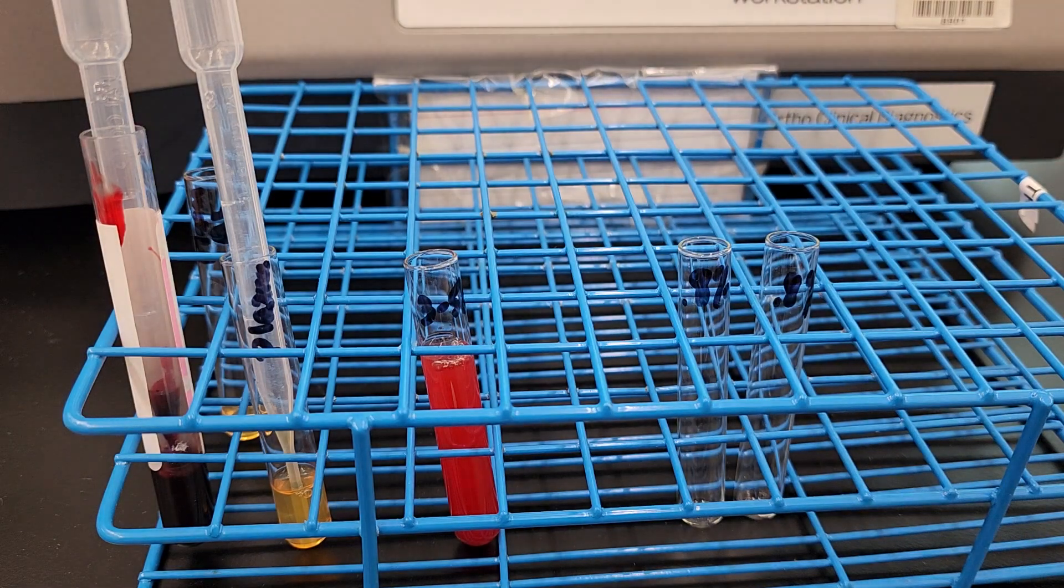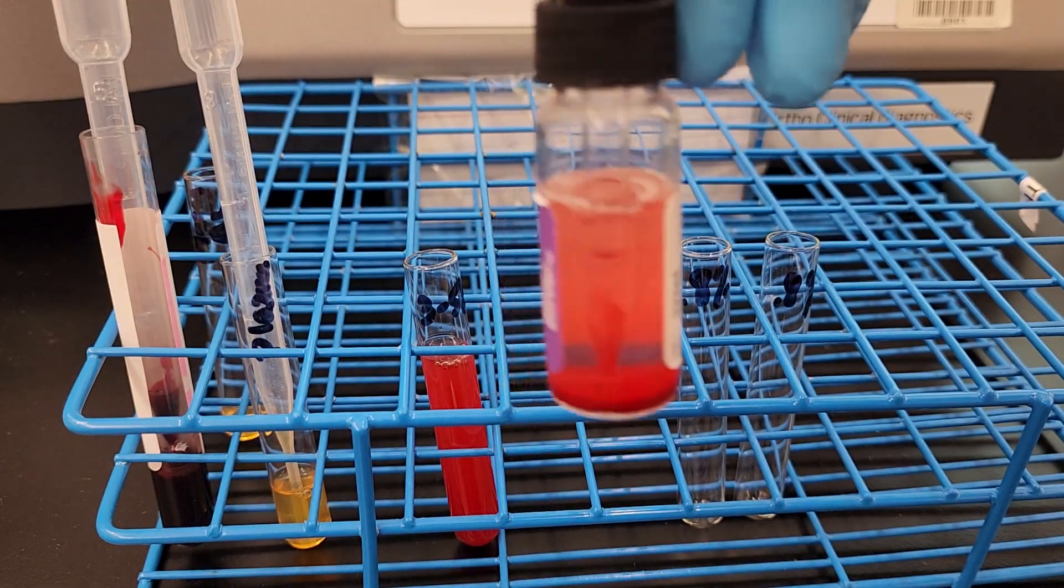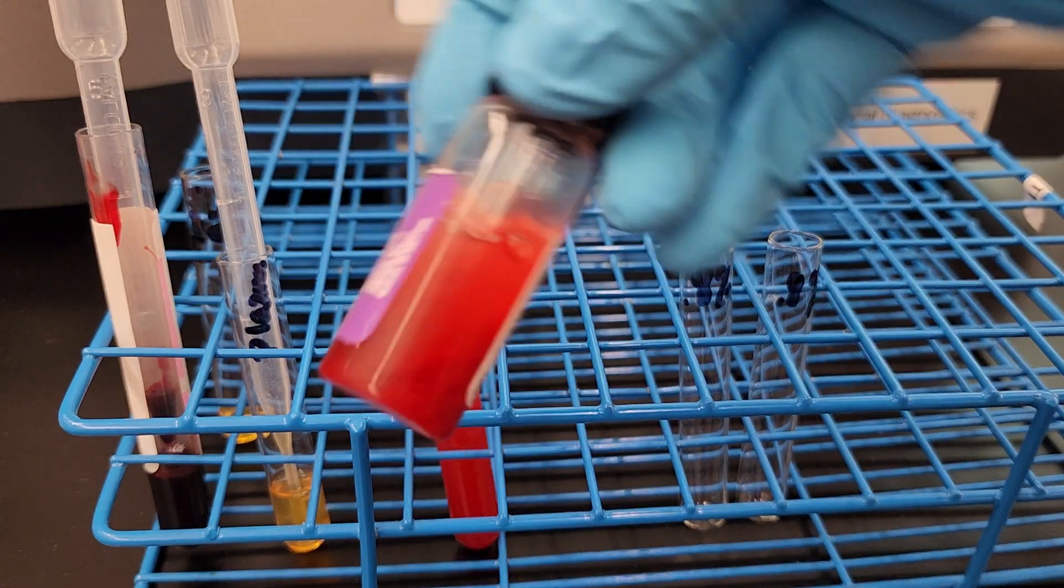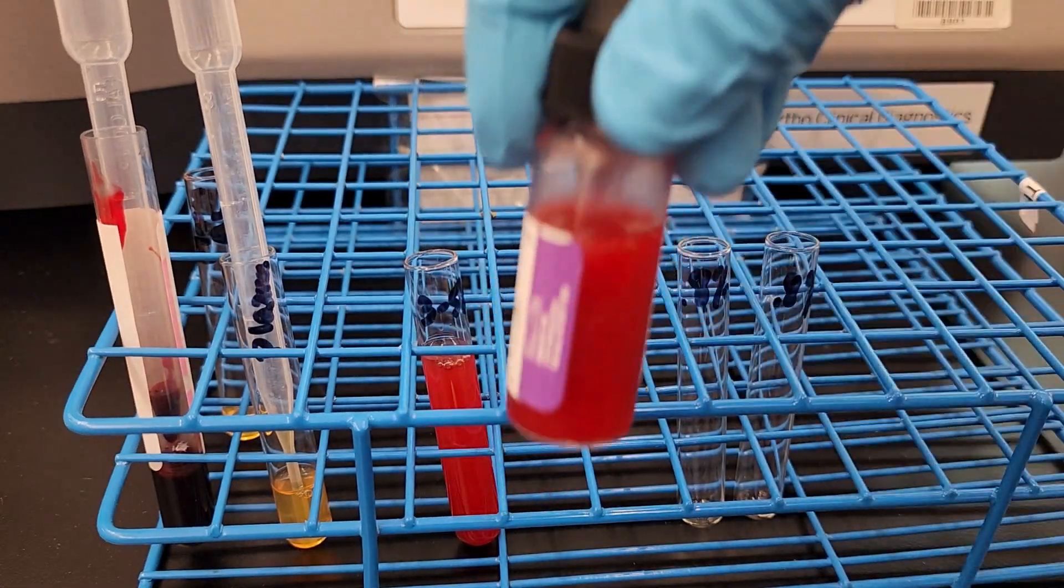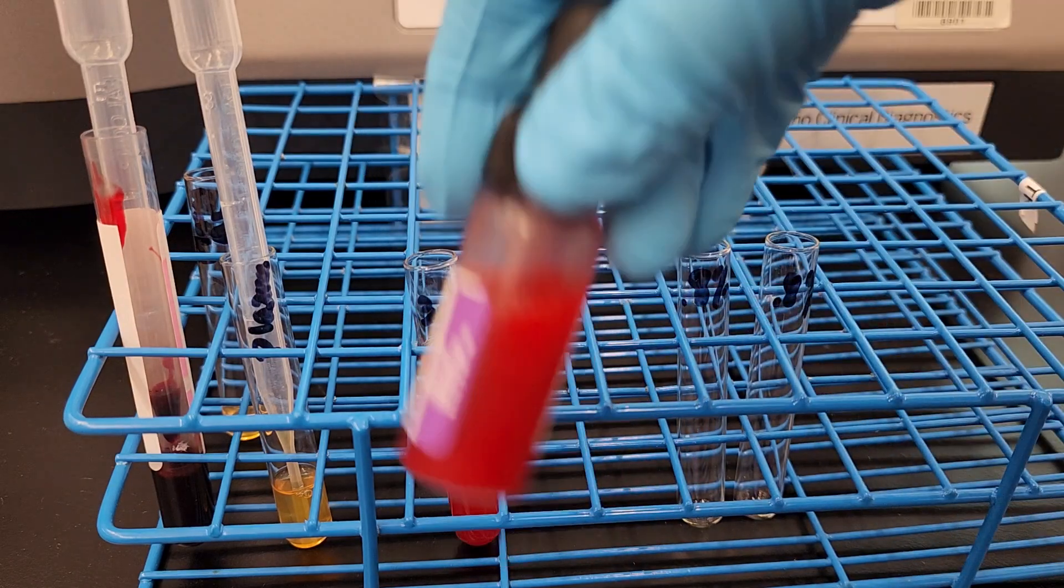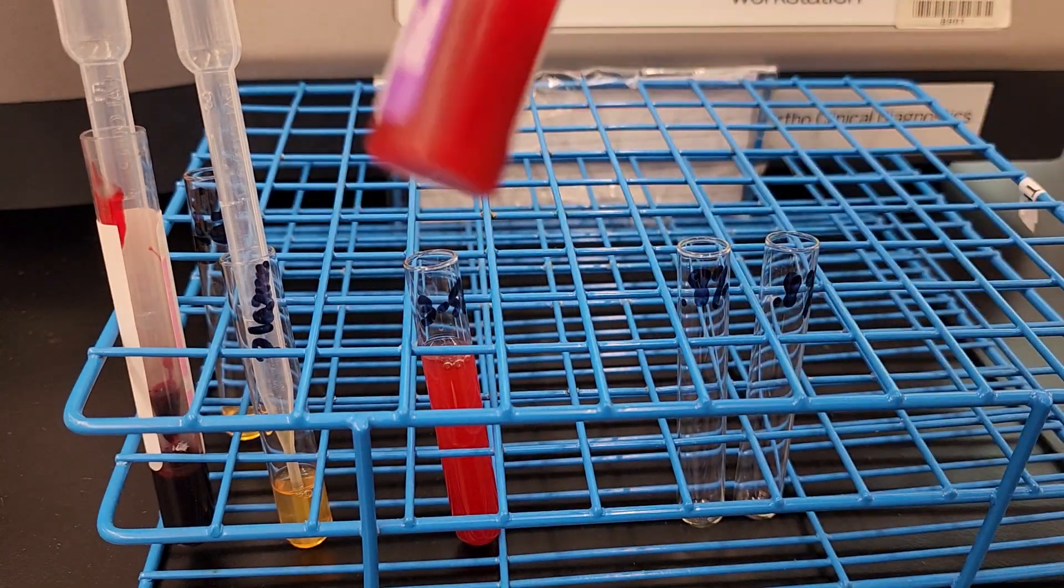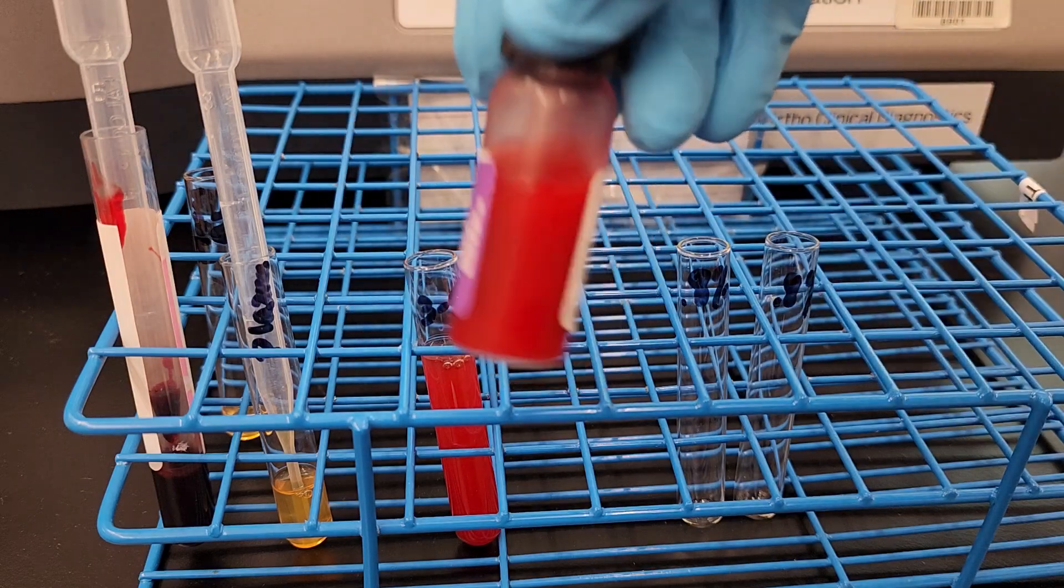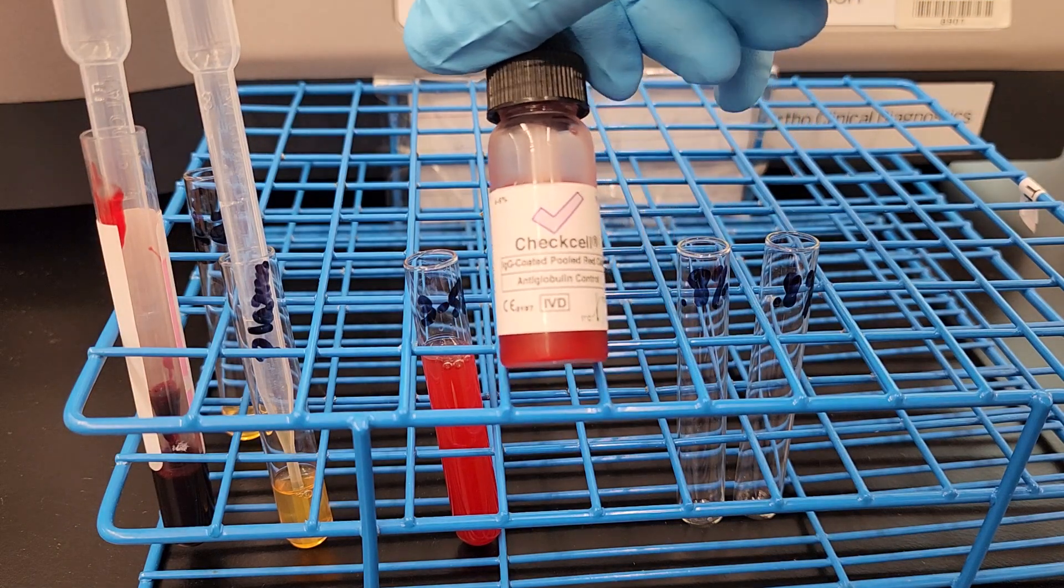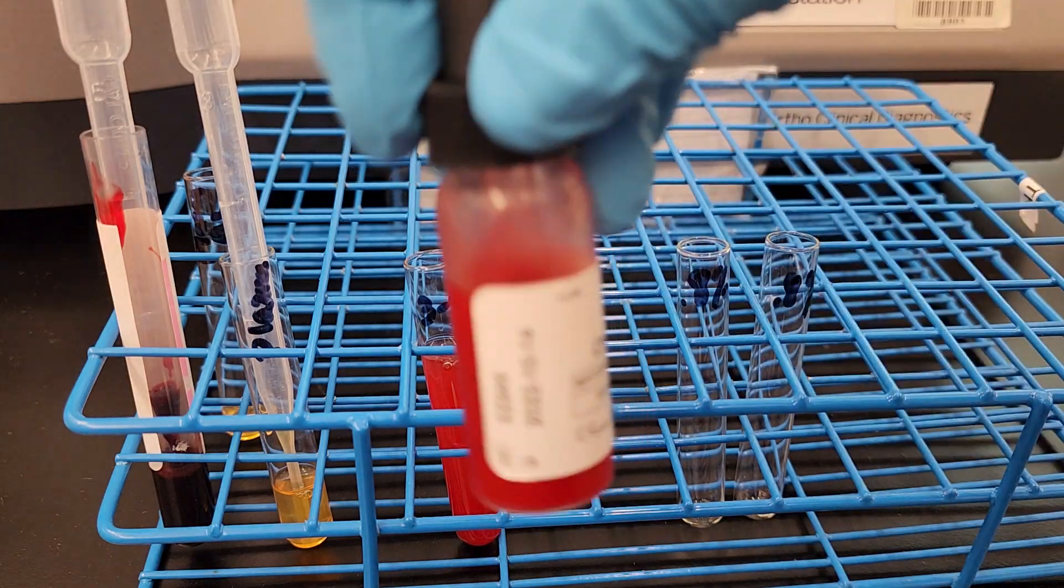So here I've got my saline. I'm going to squeeze it in there. We're going to fill it all the way up to 3 quarters of the way up the tube. And at this point, you can take your check cells, which have been in my reagent stacker. And notice it's separated. So you want to resuspend those cells. And I like to compare my red cell suspension to the check cells for the tube method. When we get to the gel part, we're going to end up comparing it to a gel reagent. Because this is a 3 to 5% cell suspension, even though it doesn't say that right at the front of the label.